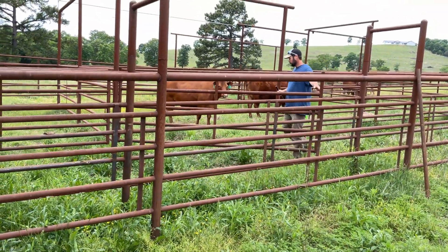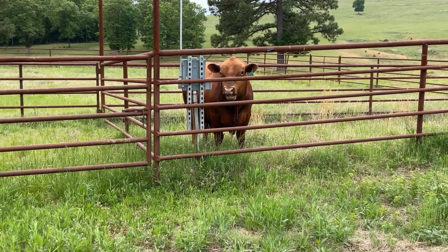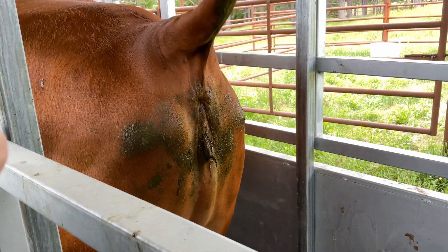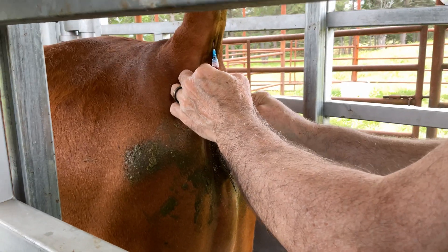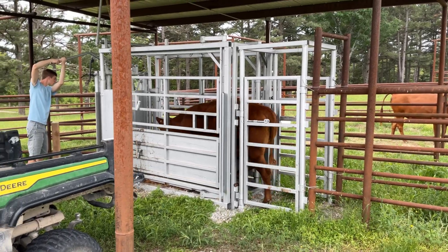We got the heifers into the corral system. Patrick was definitely not happy his girlfriends were stripped away from him, as you can tell by the look on his face. We got the first one in the head gate so grandpa could do the first blood test. The easiest place to draw blood on a cow is right under the base of their tail. You only need a few drops for the test, so we took what we needed. We then mixed the blood into the test with a solution, and then moved on to the next cow.